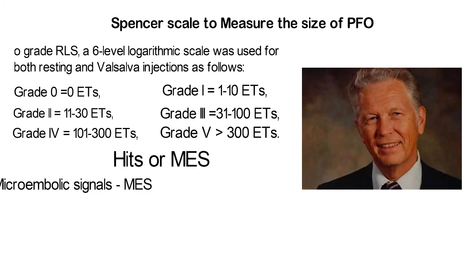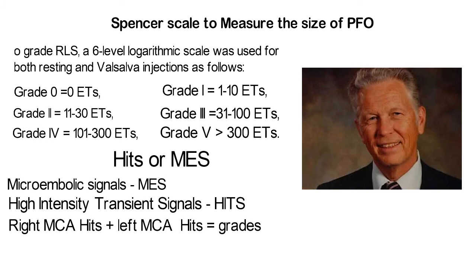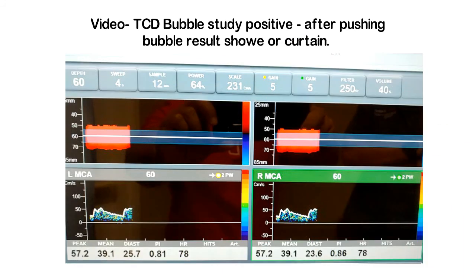HITS or MES. Microembolic signals, MES. High-intensity transient signals, HITS. Right MCA HITS plus left MCA HITS equals grades. Video: TCD bubble study positive, after pushing bubble result shows a shower or curtain.